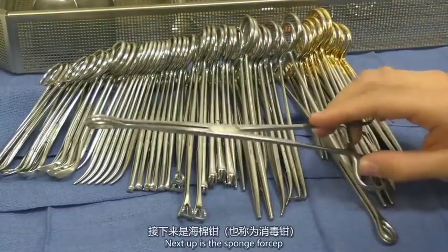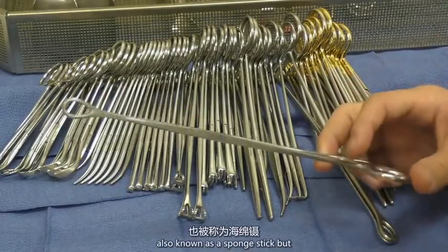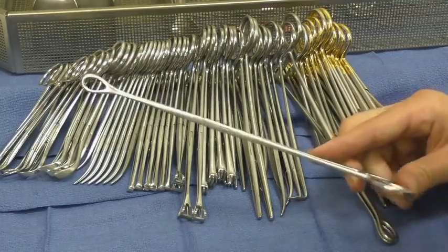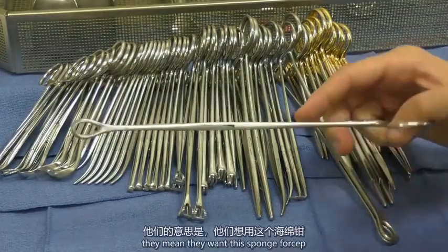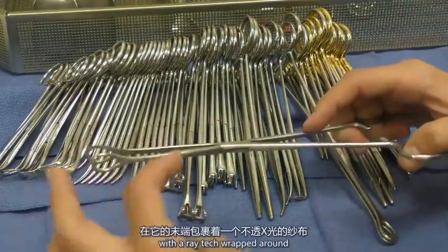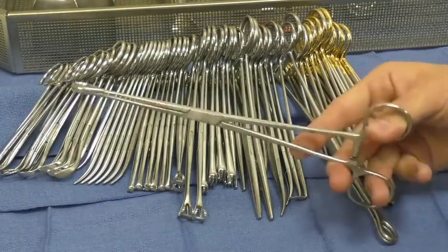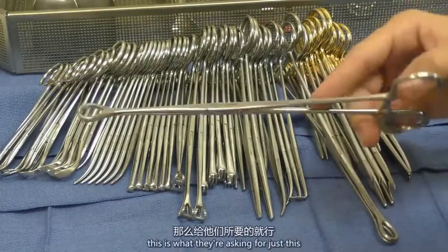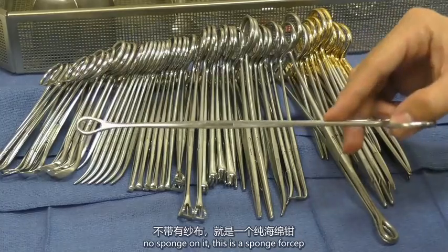Next up is the sponge forceps, also known as a sponge stick, but don't get it confused with a sponge stick. If the surgeon asks you for a sponge stick, they mean they want this sponge forceps with a Raytec wrapped around the end of it. That is a sponge stick. If they ask for a sponge forceps, this is what they're asking for. Just this. No sponge on it. This is a sponge forceps.